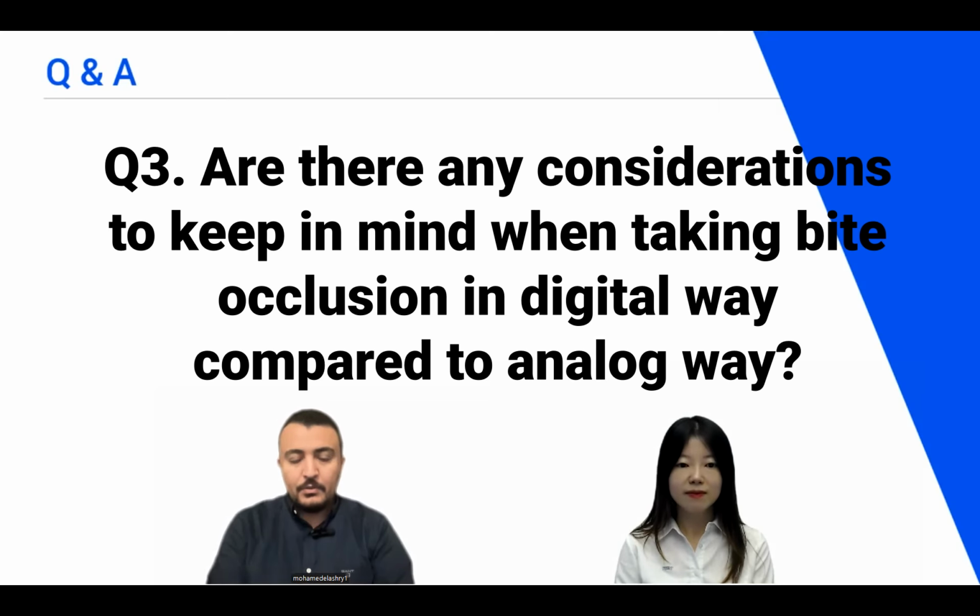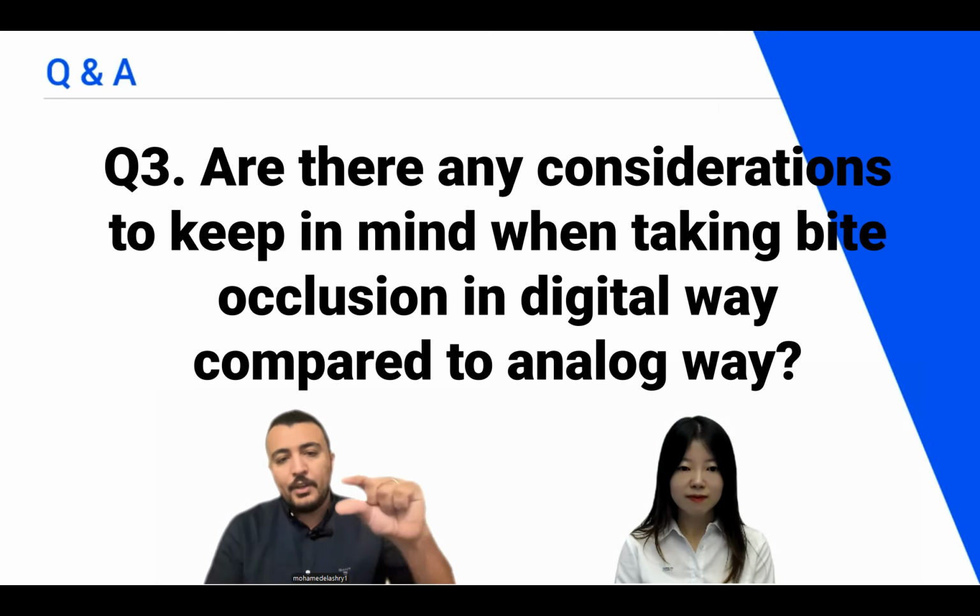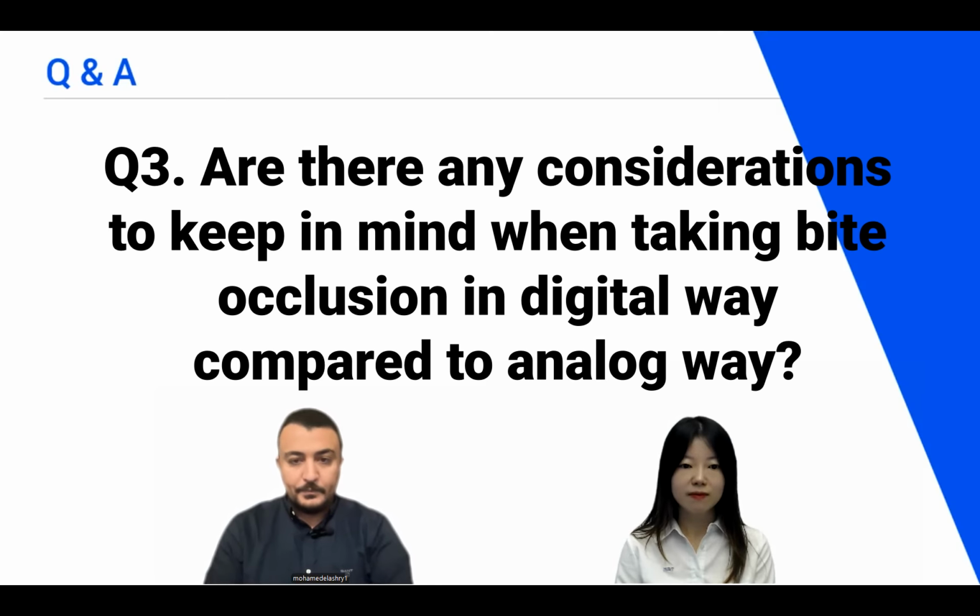And sometimes, in case I'm afraid of overclosure or tilting effect, I can make manual alignment for the one shot relationship. This is the most important thing to do with full mouth rehabilitation cases, especially when you are raising the vertical dimension or when you have a very large interocclusal distance between the opposing teeth. So usually I consider manual alignment in these cases.